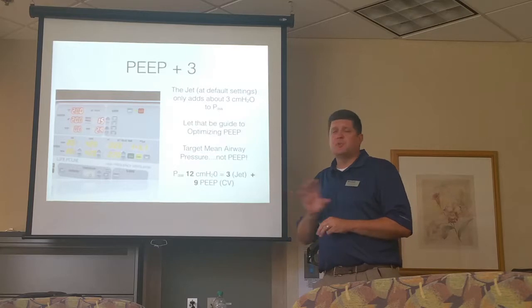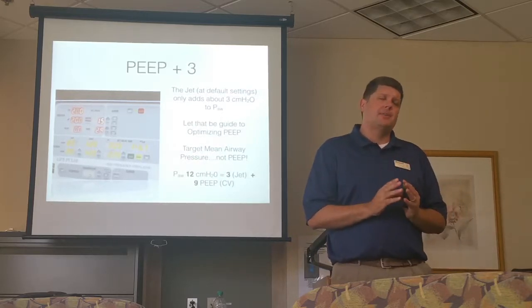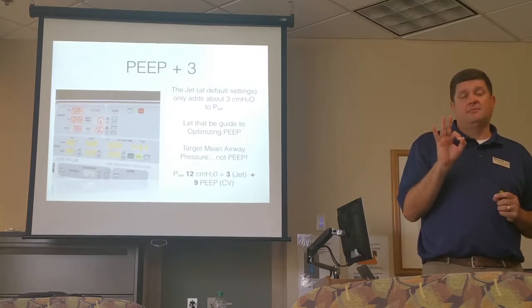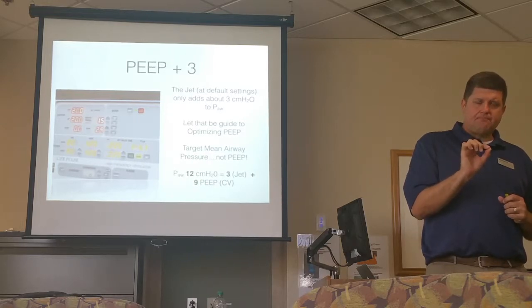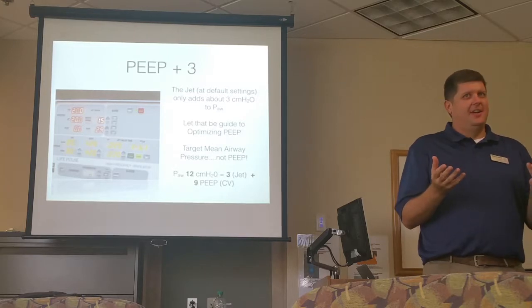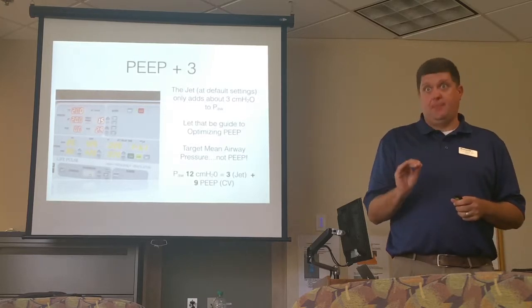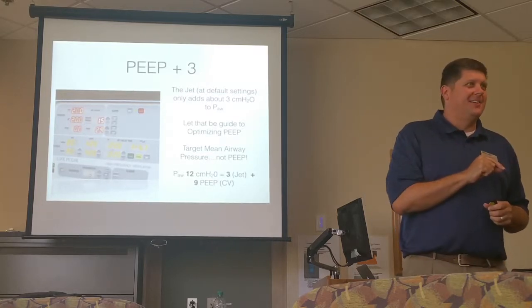The jet just running by itself, granted at the default settings, only puts in 3 of mean airway pressure. That's it. So when you're trying to optimize PEEP, and we're discussing how much PEEP we should or shouldn't be on, the real question is, what mean airway pressure do you want to be on? From that, we'll figure out how much PEEP you want to be on.